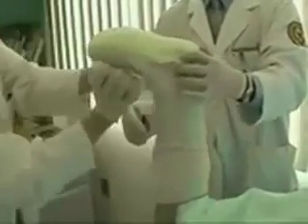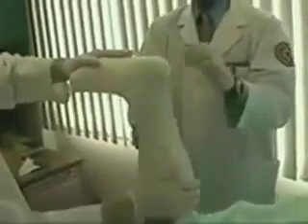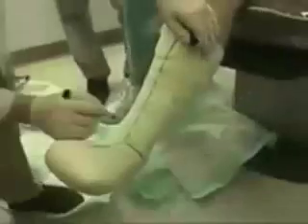We will then apply our final layer of fiberglass, which can be applied slightly more tightly and snugly than the others. Once finished, we will have a completed ambulatory total contact cast, which in about one half hour will be ready for light ambulation in a cast boot.